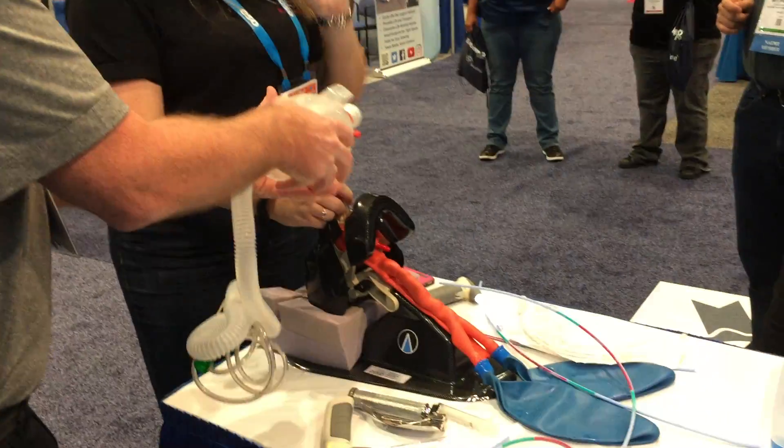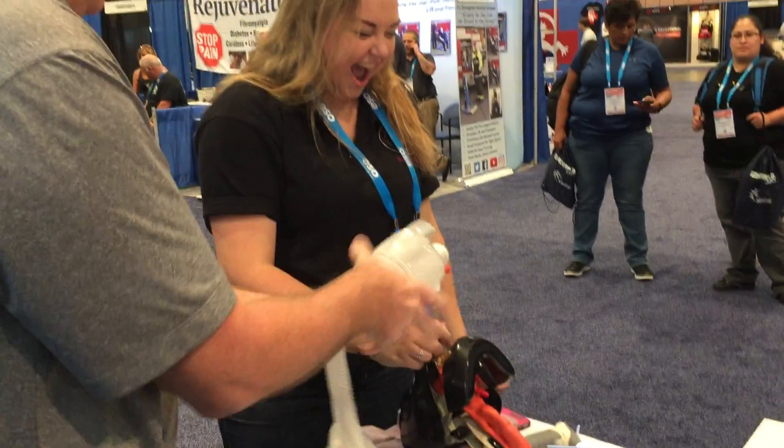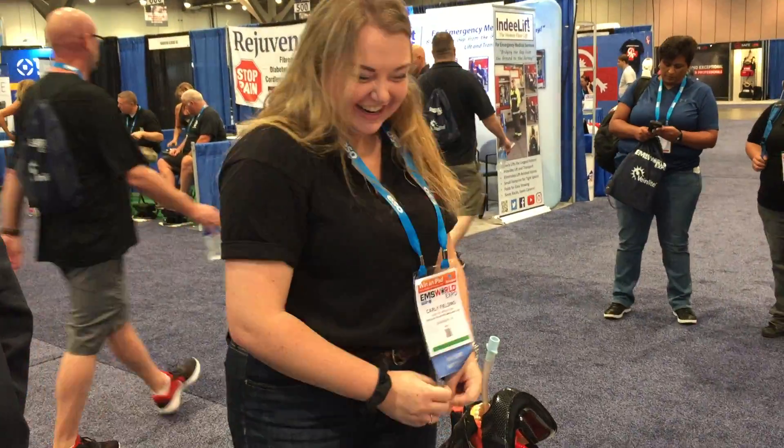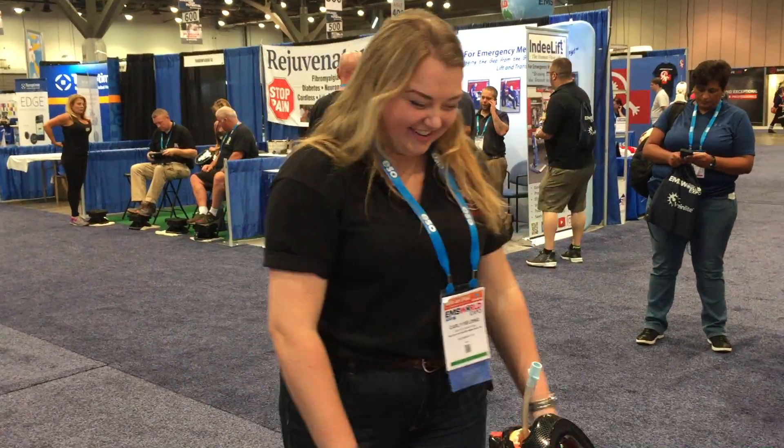Now Matthew should have jumped up and bagged, but I'll bag it. Boom, look at that. Was that your first time? Yeah, that was my first time. Excellent. Good job. Awesome. Thank you.